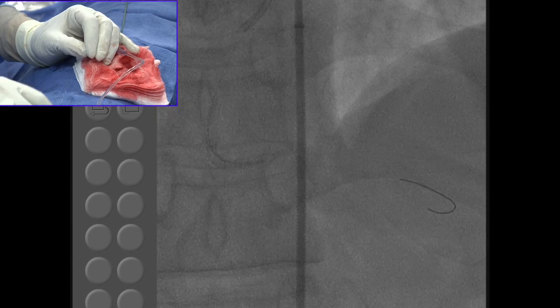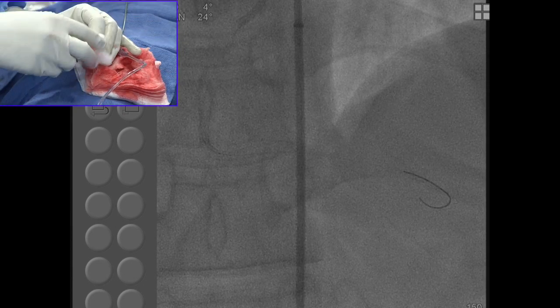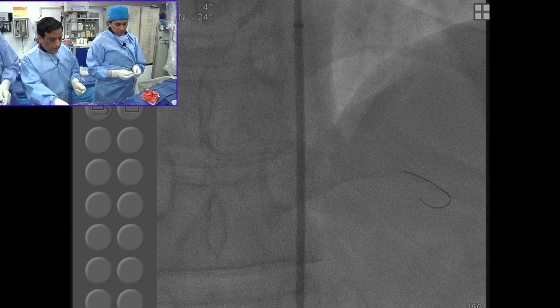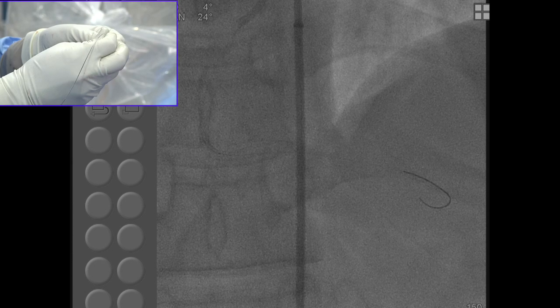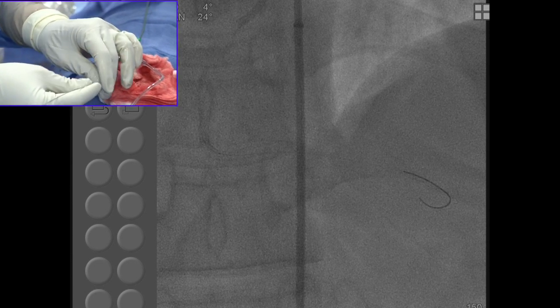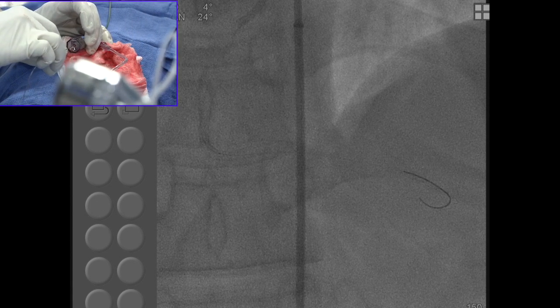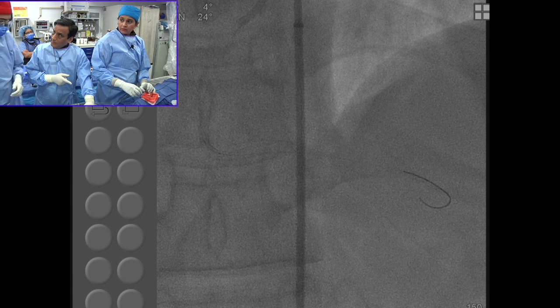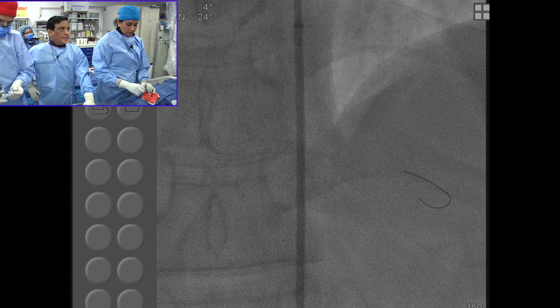And of course, once you have a little issue in terms of the flow, you'll have higher restenosis as well as reocclusion. So therefore, both retrograde as well as antegrade subintimal dissection, I'm still cautious about till we know clearly this data in an antegrade fashion. This is a what, 2.5 by 12? Yeah.